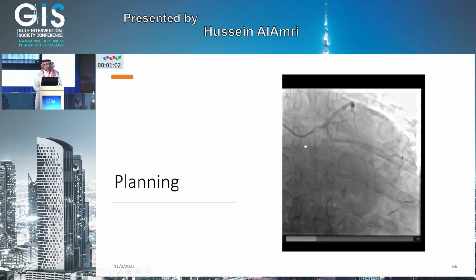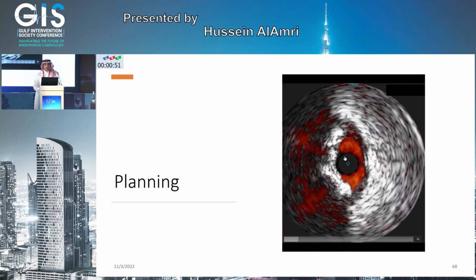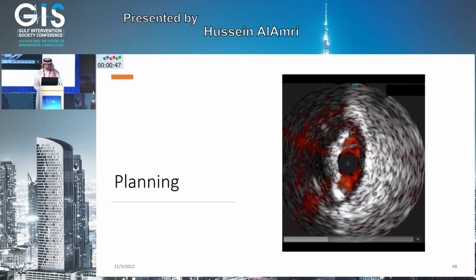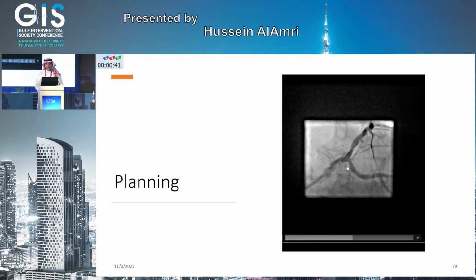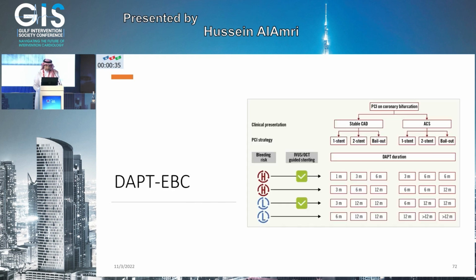This is a calcified left main, and the operator decided to go for intervention without debulking or without assessment with IVUS. However, it was a non-dilatable lesion, so he did an IVUS, and there was around 180 degrees of calcium in the coronaries. Despite that, he decided to go for a larger balloon. And what he ended up with is significant dissection, which complicated his procedure, and he had to extend his stent into the LAD.